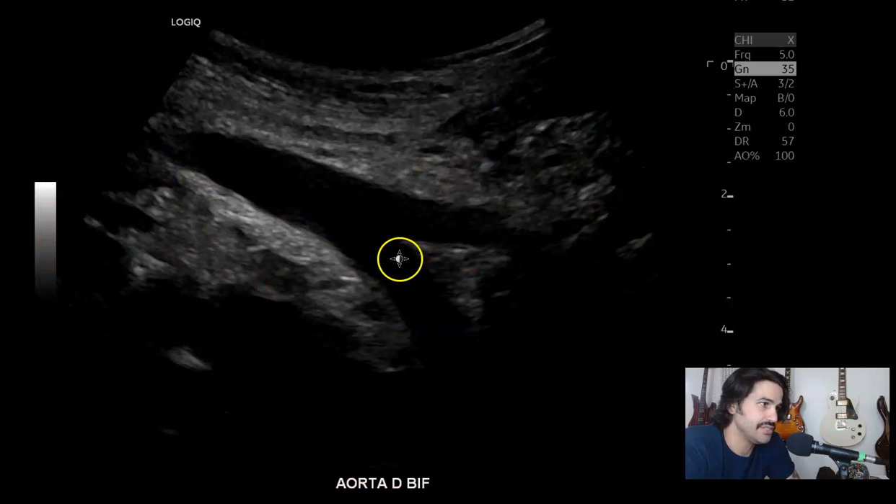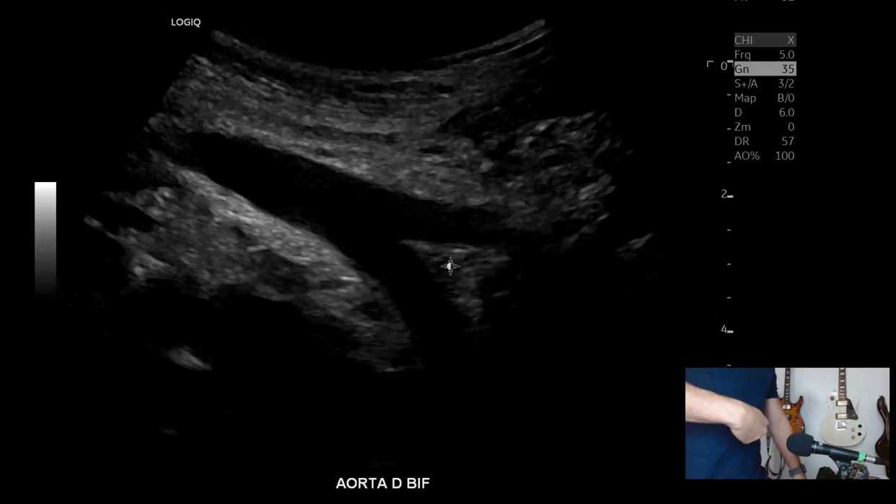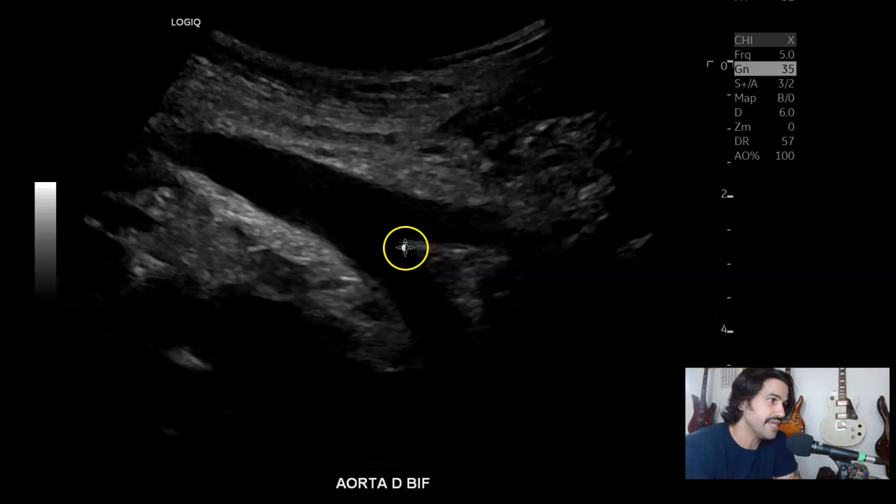And then the bifurcation. In order to get the bifurcation, you're not going to be able to get it at midline. You're going to have to go coronally from the right or the left — whichever side allows you to see it. Hopefully there's not so much bowel gas — with some increased pressure you'll be able to see it. You should be able to get the bifurcation in some patients, but you have to go coronally through the sides.